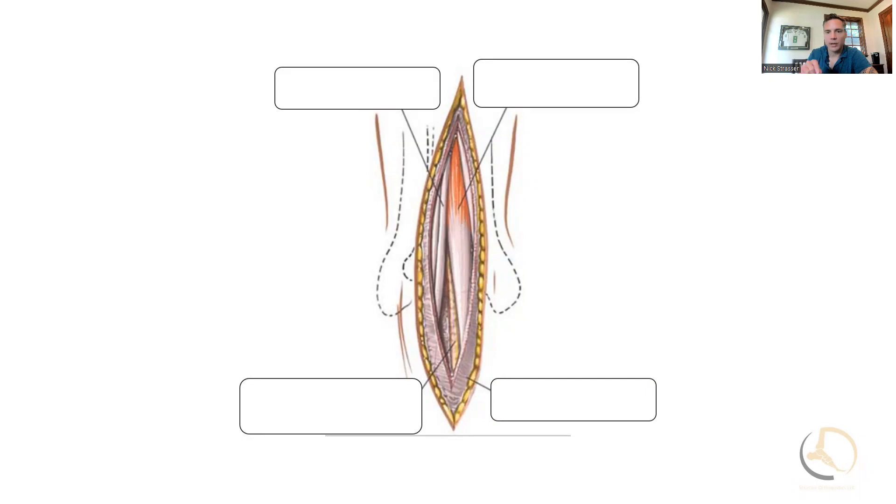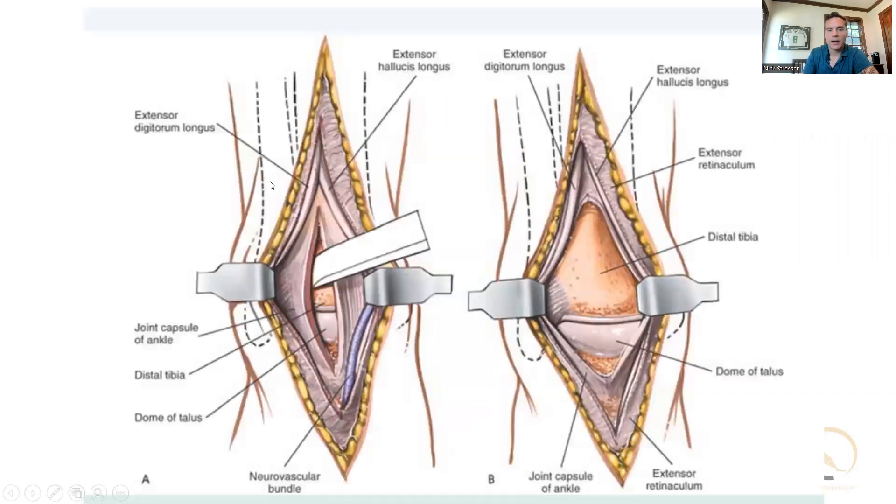Proximally, I'll go in with tenotomy scissors at the proximal aspect of the wound, dissect and find the neurovascular bundle there, and then retract that laterally. Once I find it proximally, I feel more confident going kind of straight to bone. I don't undermine a ton of tissue; I create deep flaps all the way down to bone to minimize the chance of wound complications. Then I'll work my way distal and create these flaps, usually with a scalpel or a Bovie.